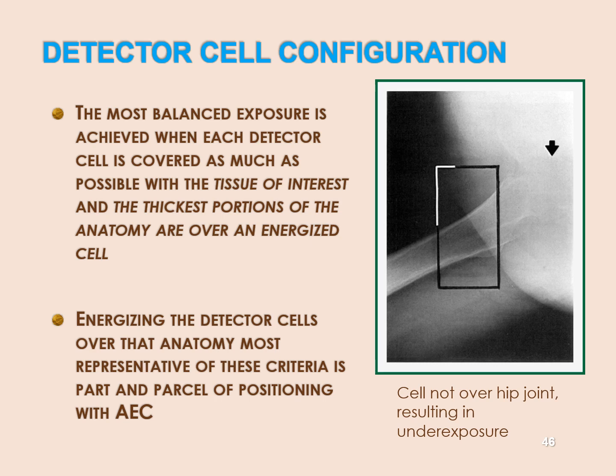So put that over the active ion chamber. Next, align the active center cell. I'm not saying you can't shoot a hip with center cell. I'm saying your centering needs to be on point if you don't want an underexposed one. Because if you're centered over the shaft, then you don't have enough X-ray to get through the pelvis adequately. Okay, those are two different part thicknesses.